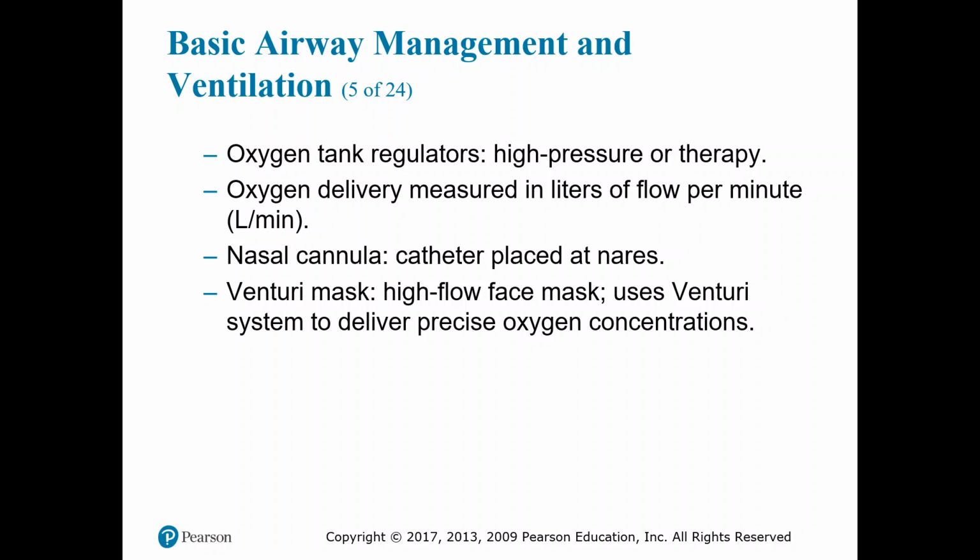So our oxygen delivery is measured in liters of flow per minute. A number of delivery devices are available, and we're familiar with most of these. The patient's condition will dictate the method and the delivery device that you use.